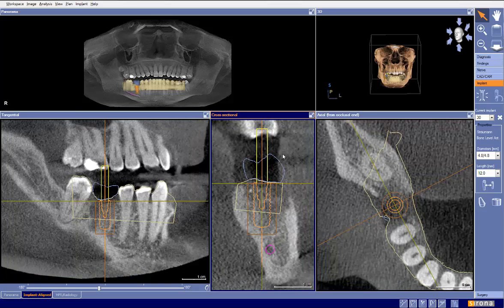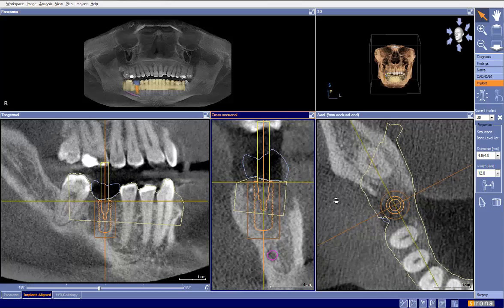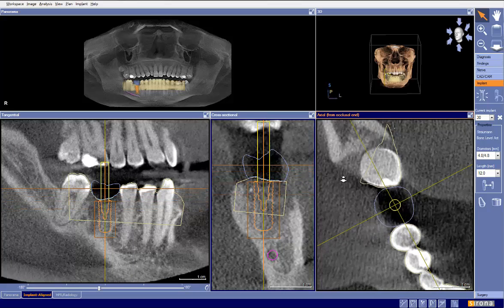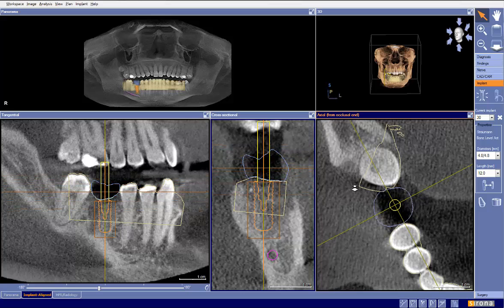If we go through our checklist, mesiodistal positioning looks very nice, pretty well centered. Our buccal-lingual positioning looks pretty well centered. Our bone level position — and this is where I first notice, maybe I don't want to use the word error, but some area of concern here.